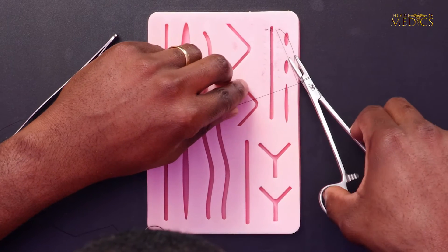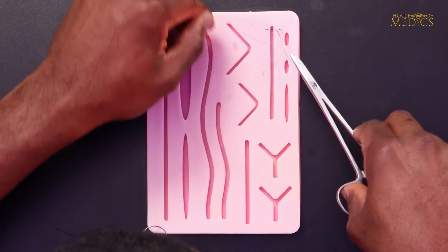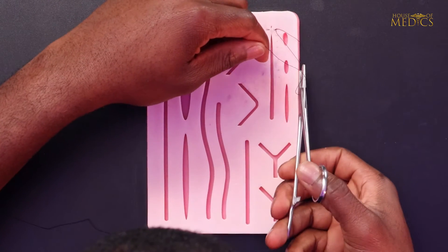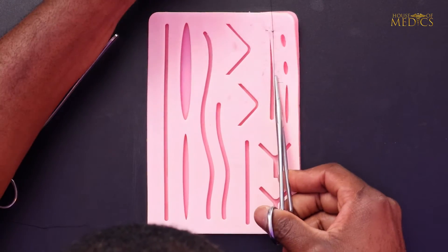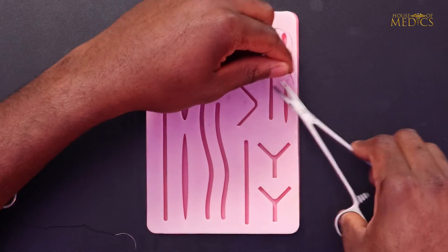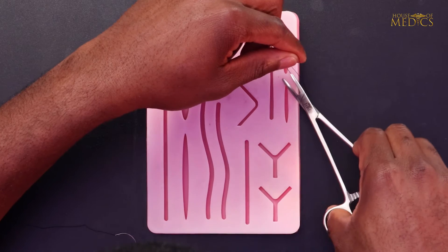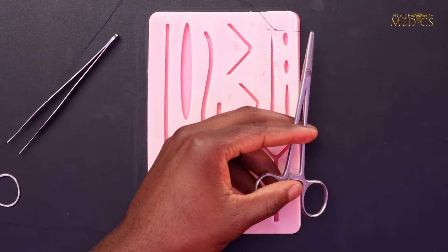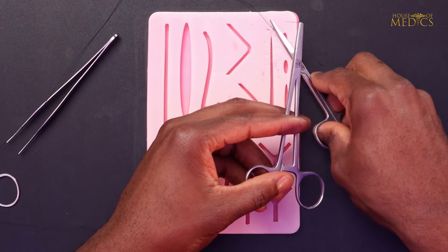You don't tie these off in the usual fashion. After remounting your needle, you can trim your excess end.